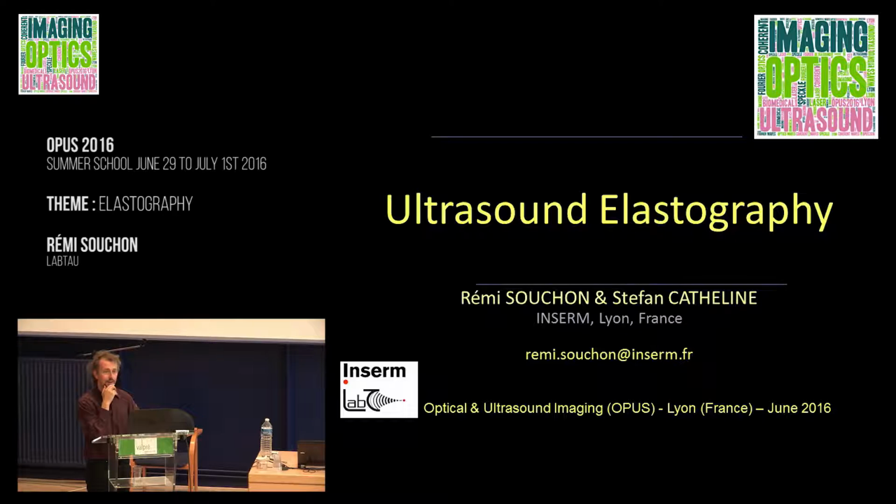I have a question about the last slide. Do you use B-mode image or RF? These are the ultrasound signals, so we always use the RF data. And the reason is we get micron precision with RF, whereas with the B-mode it will be in the millimeter range.